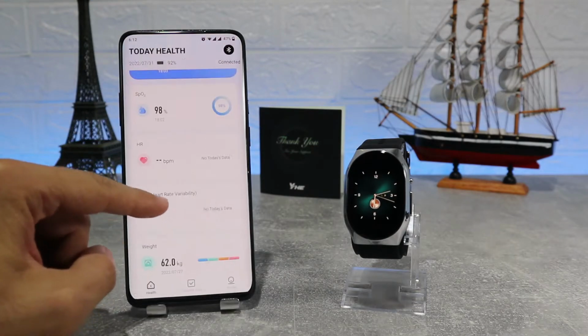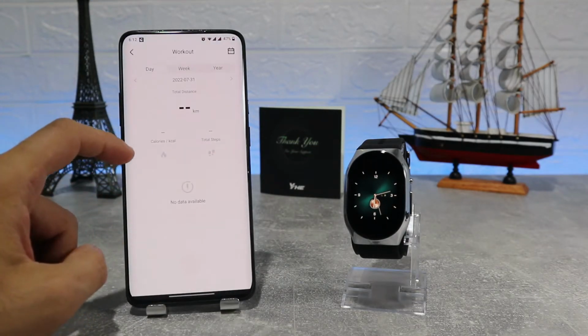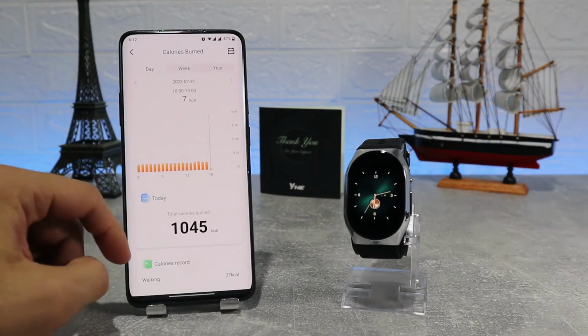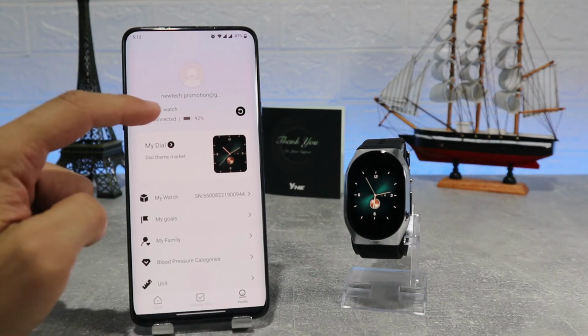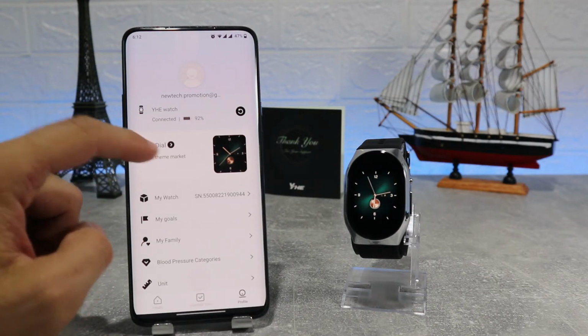Next, we have a profile page. On the bottom, we can see the watch name, the status of our watch if it's connected, and battery percentage.